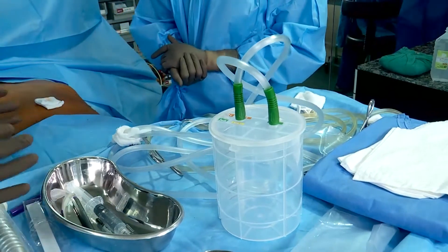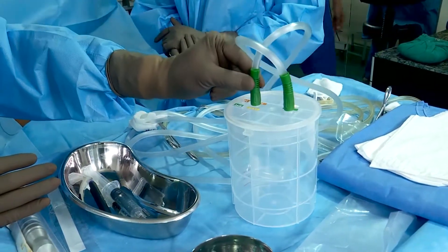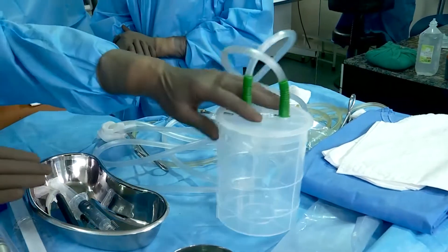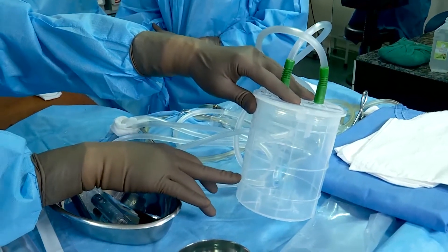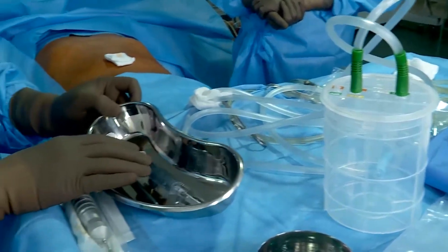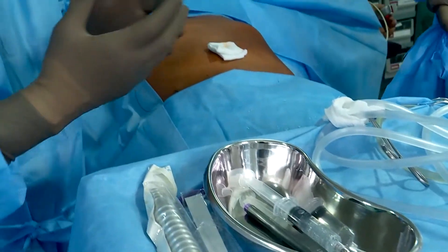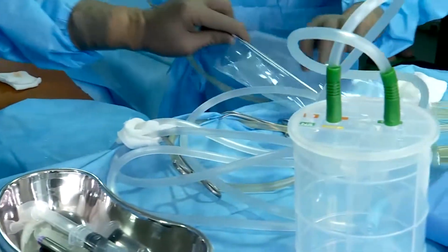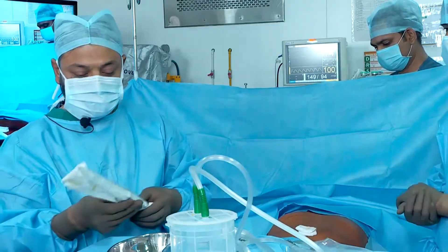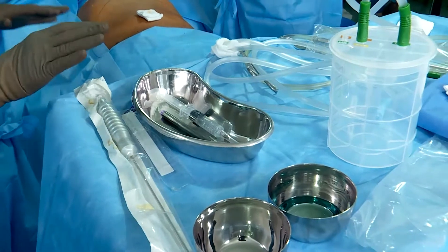This is the table on which we collect the fat. This is a box we have designed, which has one outlet for negative suction and another inlet for the lipoaspirate which will come into the box. Initially we will fill it with approximately 300 ml of normal saline and soda bicarb to neutralize the lipoaspirate. For instrumentation we need an 11-number knife, local anesthesia, a skin marking pen to mark the area where we get the fat, one infiltration cannula through which we infiltrate the tumescent anesthesia, and one suction/lipoaspiration cannula.